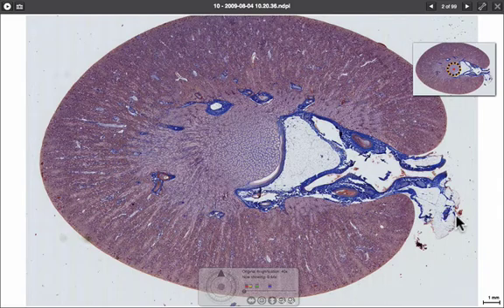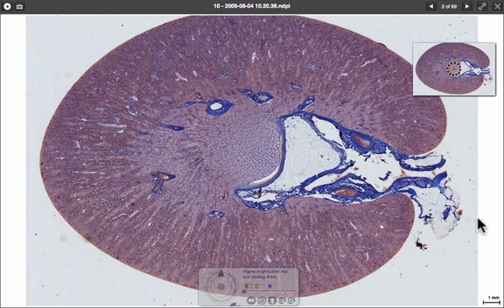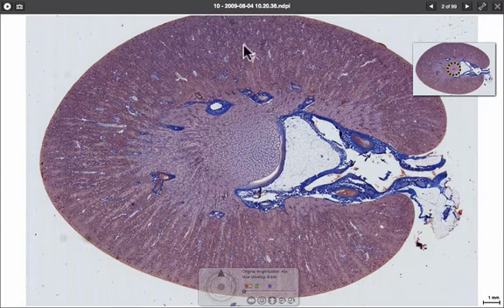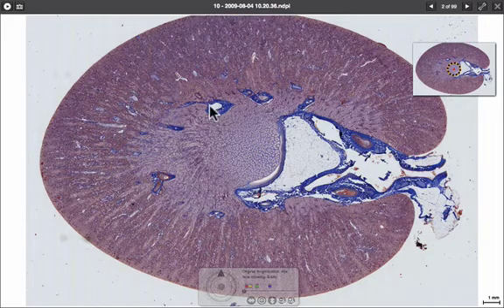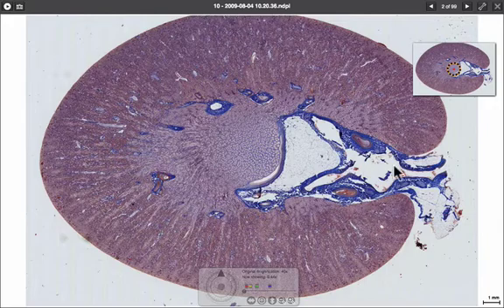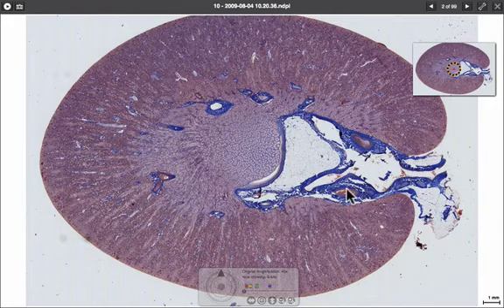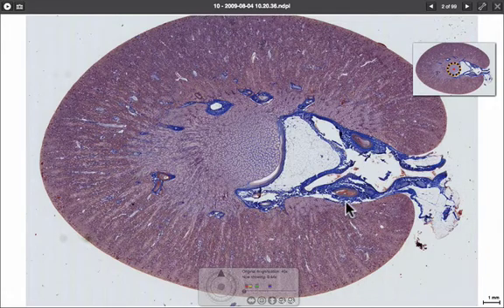Here we have an alcian blue stained section of a kidney. Around the outside we have the cortex, in the middle we have the medulla, and we have the blood vessels — the renal artery and its main branches coming into the kidney here.